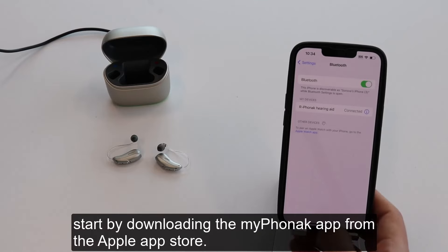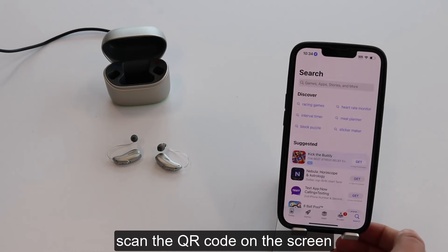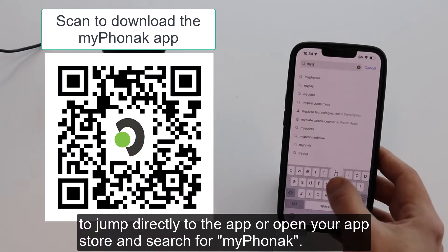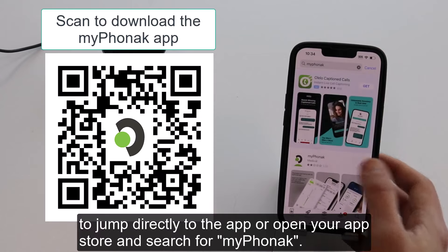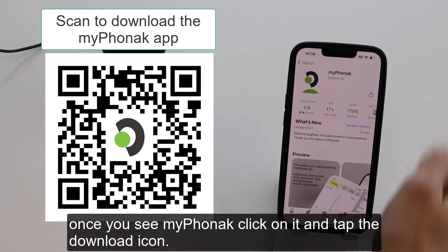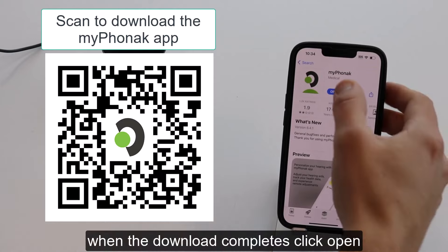Start by downloading the My Phonak app from the Apple App Store. Scan the QR code on the screen to jump directly to the app, or open your app store and search for My Phonak. Once you see My Phonak, click on it and tap the download icon. When the download completes, click open.